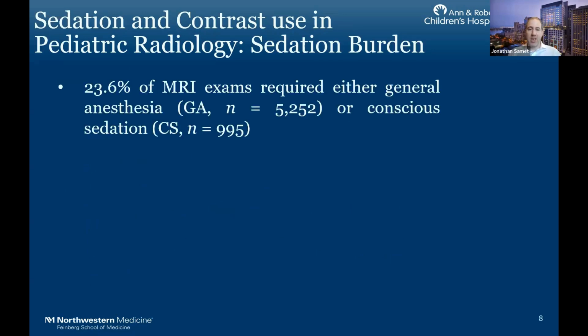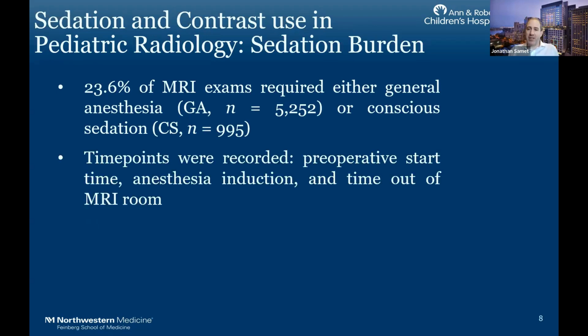Then we looked at sedation burden, so actually the anesthesia. And we found that about a quarter of our exams required either general anesthesia or conscious sedation. And again, we had to make certain time points to define what's going on here. And we looked at the preoperative start time. Okay, when you first start in the room and you check in. Then when they actually put you to sleep, right? All of that time is non-scanning time. They put you to sleep, and then the time of the scan, and then you're out of the room.